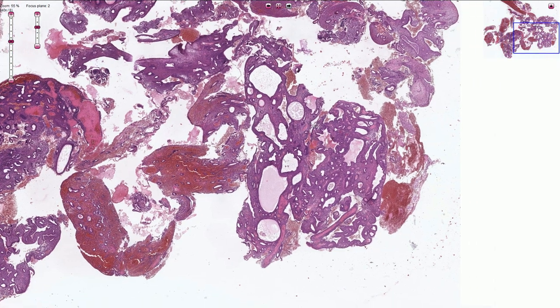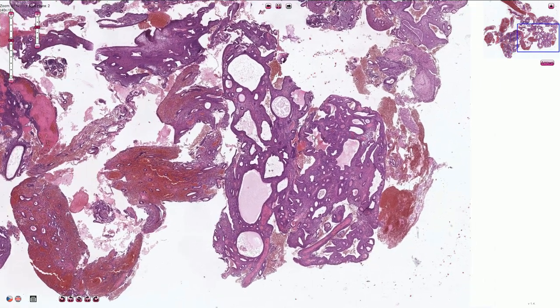Simple endometrial hyperplasia is typically described as having a swiss cheese pattern, meaning that these dilated endometrial glands look like the holes in the swiss cheese.